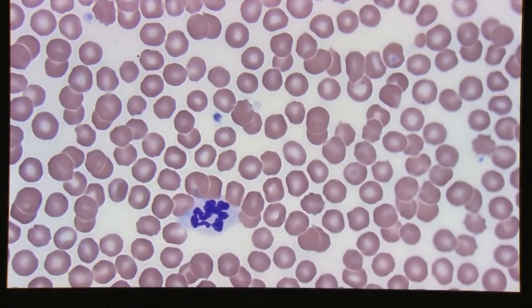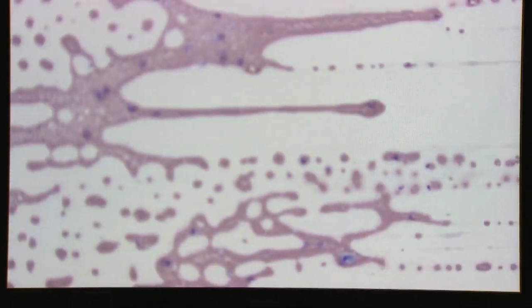But going back to 10 power, if you've checked out in your feather edge, then you'll see, oh, they're probably okay because there's lots of big clumps out here. So that's probably the largest reason to check your feather edges for platelet clumps.